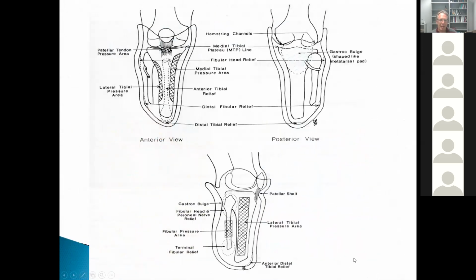Okay, now here's a drawing that is showing the pressure tolerant areas. And this is one of the things that we're going to do in a couple weeks. So I think I demonstrated this. This is very heavy. So we're going to have a bunch of these, and please don't wallop me or any of your classmates with it because it's very heavy.